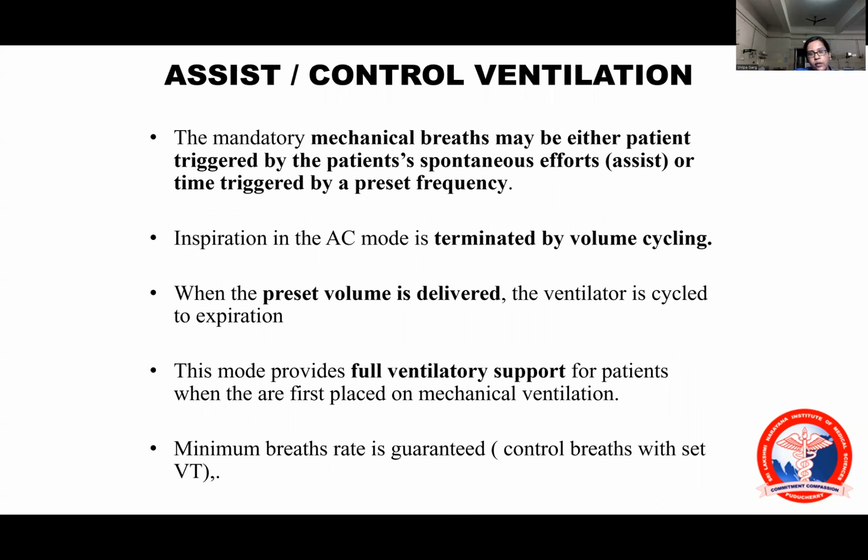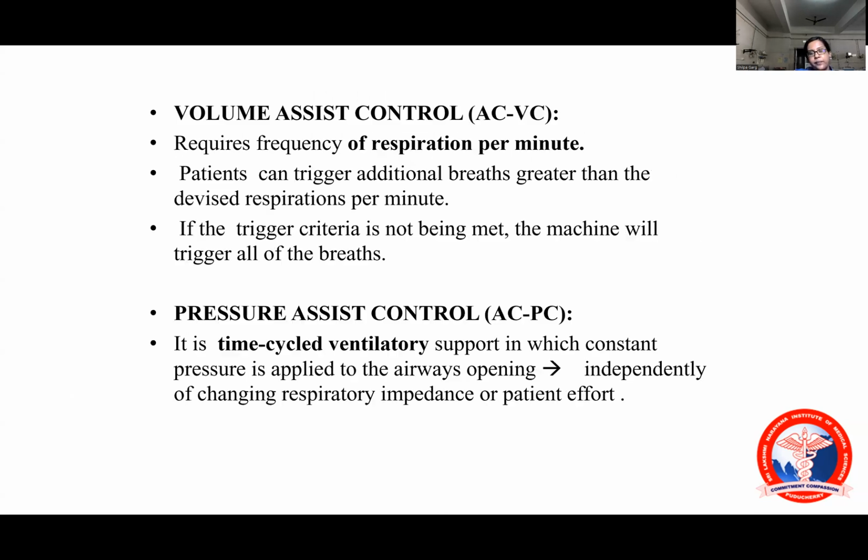Coming to assist control ventilation. Mechanical breaths may be either patient triggered by spontaneous efforts, or time triggered by a preset frequency. It is terminated by volume cycle, so the preset volume is delivered. We set the volume and it gets delivered, and the ventilator cycles to expiration. This mode provides full ventilator support for patients when first placed on mechanical ventilation.